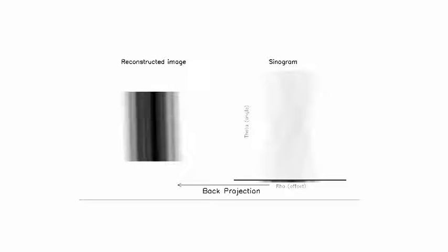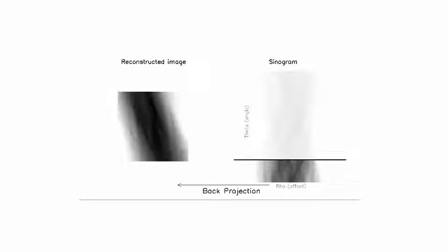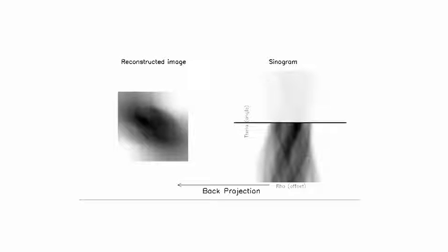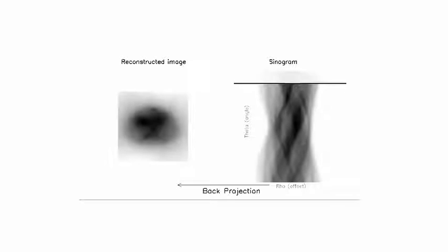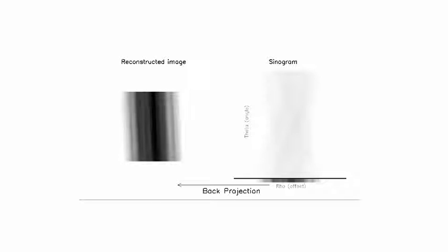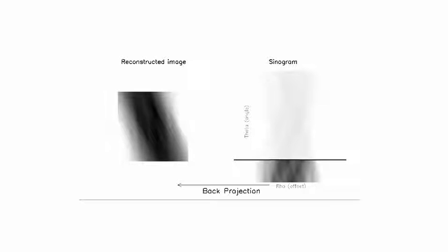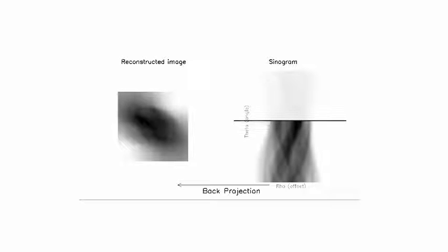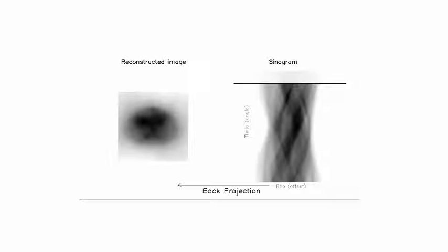In mathematics, the Radon transform in 2 dimensions, named after the Austrian mathematician Johann Radon, is the integral transform consisting of the integral of a function over straight lines, as we use in CT. We have 2 ways that modern CT uses. One is the inverse Radon transform, and the other is the fan-like way.